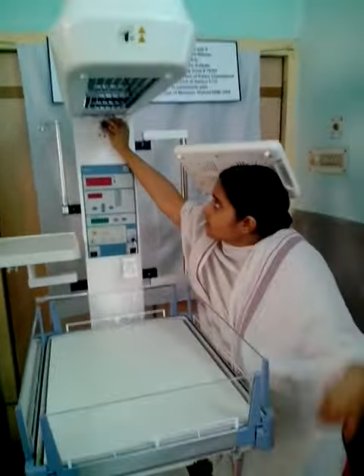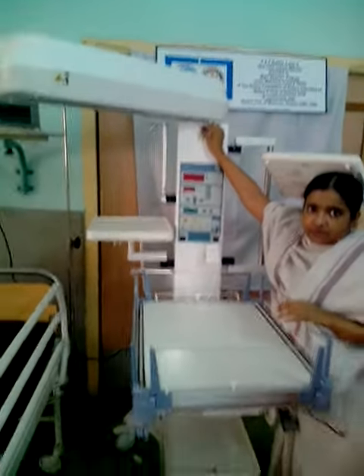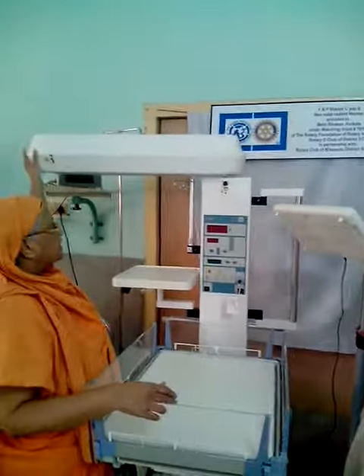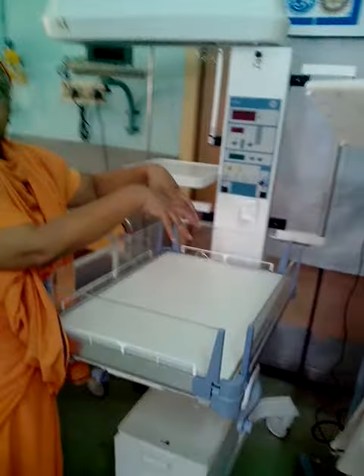When we take the X-ray, we can remove it this way. When we shift it like this, the X-ray will come in and come out here. This is a big plus point.